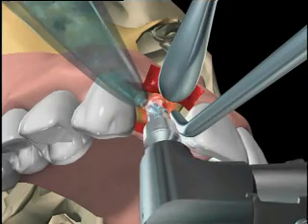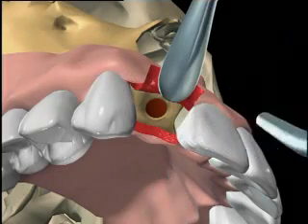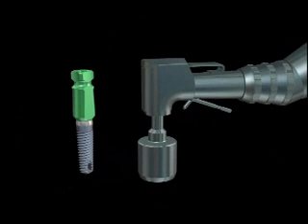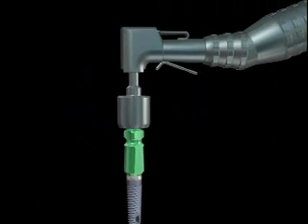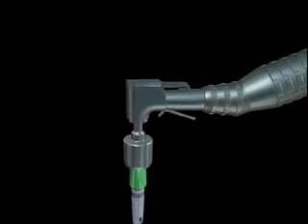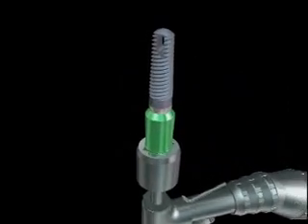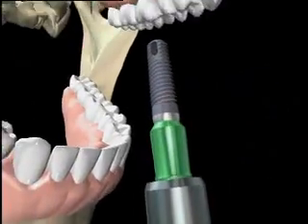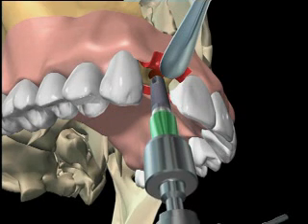The dense bone protocol, featuring a stepped final drill, is shown here. Every tapered screw vent implant comes with a fixture mount that also functions as a transfer and a preparable temporary abutment. The tapered design allows the apical portion to guide the implant into the osteotomy before self-tapping initiates.